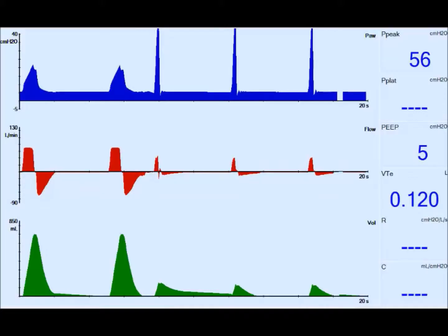Premature cycling is also known as premature termination or short cycling. It occurs when the ventilator breath cycle ceases abruptly while the patient requires a longer inspiratory phase. It's usually attributed to a pressure overshoot, which causes the breath to cycle off when it hits the alarm limit.